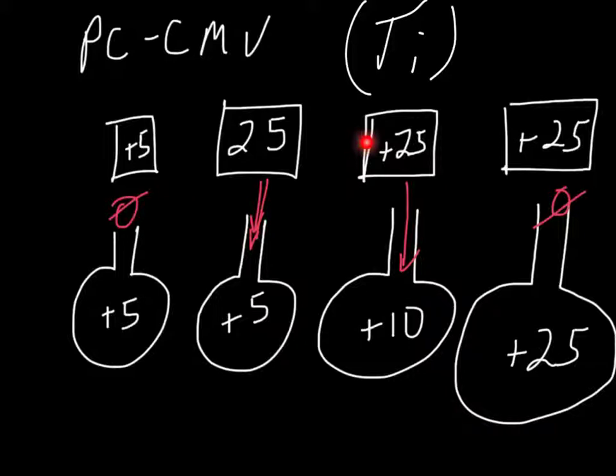All right? Now, we've established our pressure control level at 25, so this is going to be held for our 2 seconds, because remember our TI established was 2 seconds. And then at the end of that, or just before the end of that TI, we have equilibrium between the mouth pressures, or the ventilator pressures, and the lung pressures. So once again, there'll be no flow.